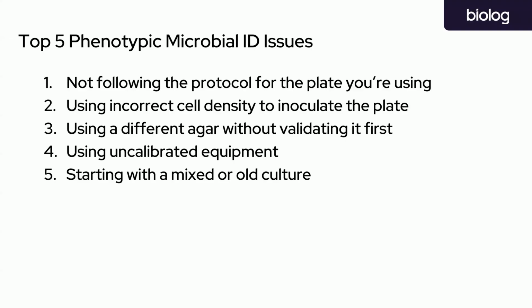So we recommend that your cultures for bacterial applications are younger than 48 hours old. Typically we shoot for 24 hours for bacteria where possible, and for yeast, try to keep it under 72 hours old.